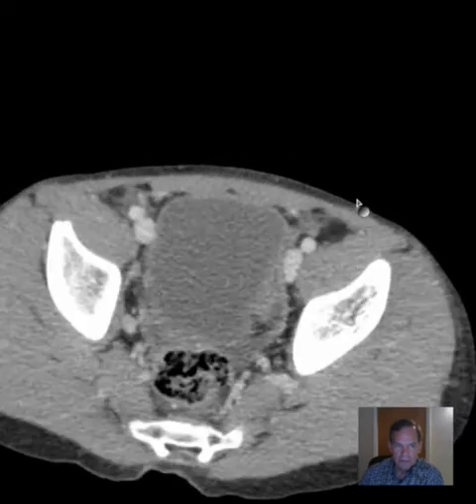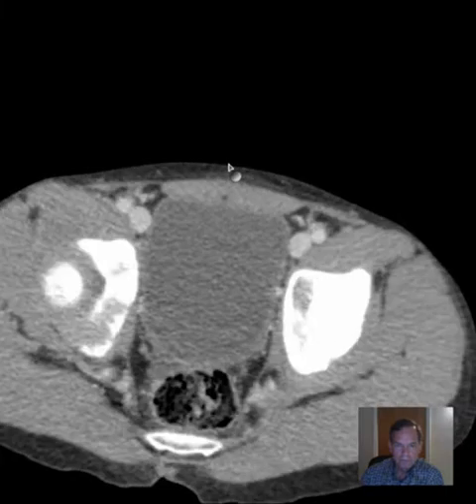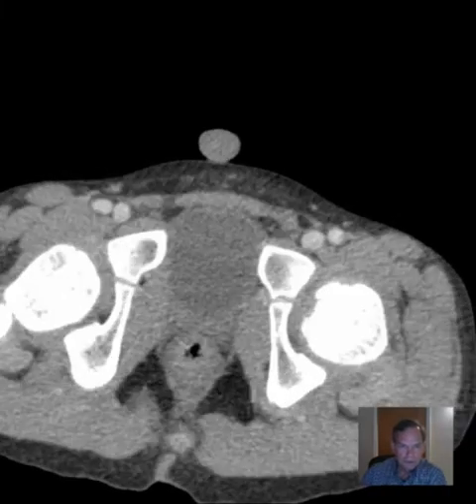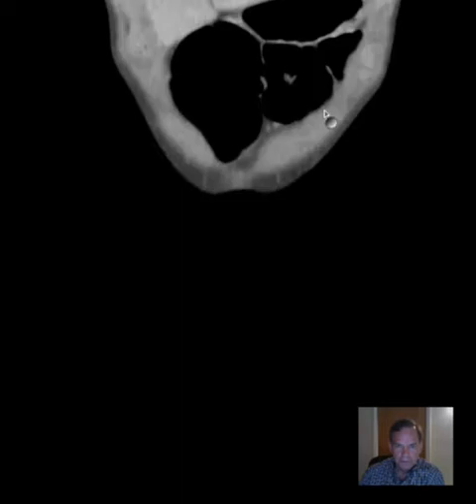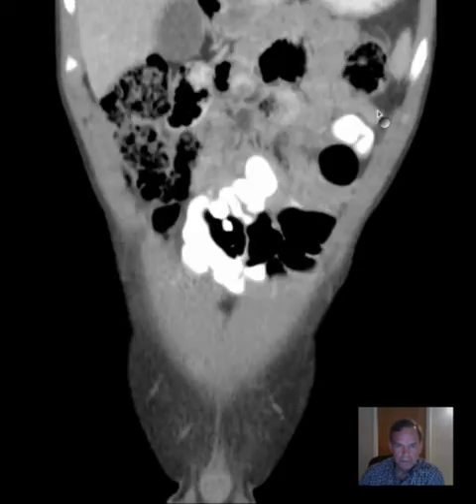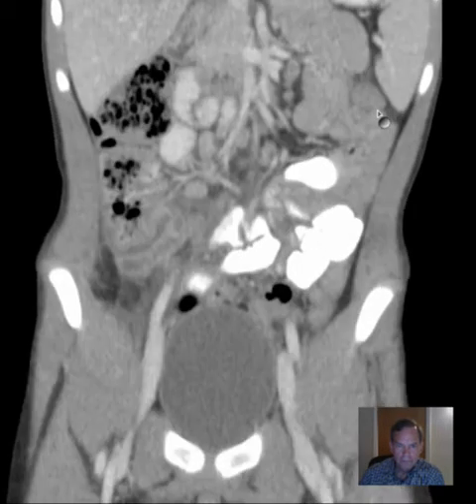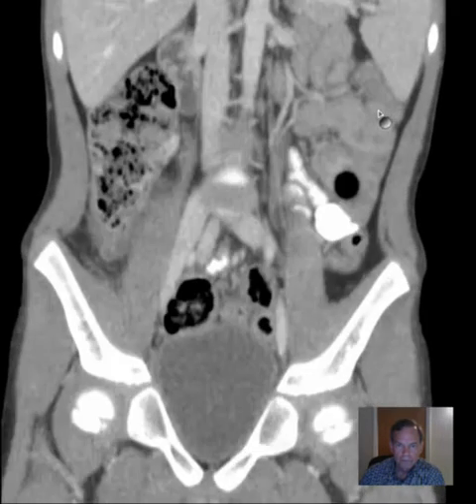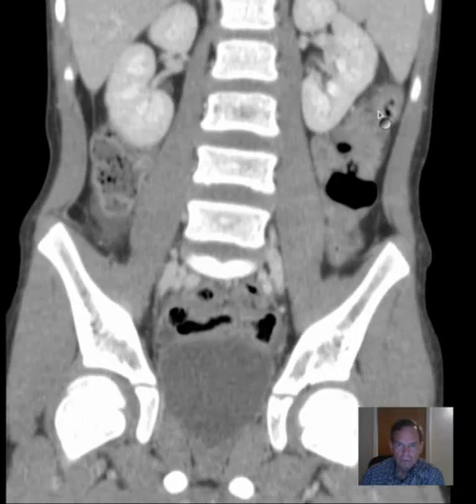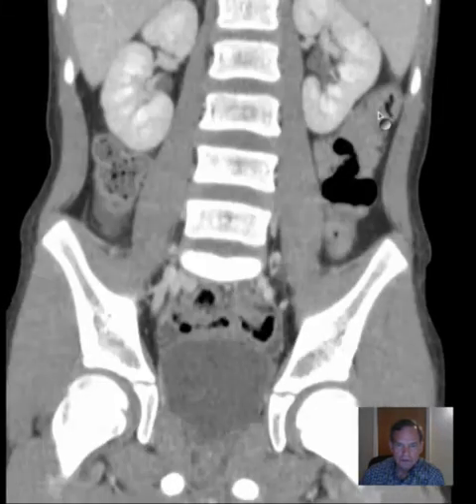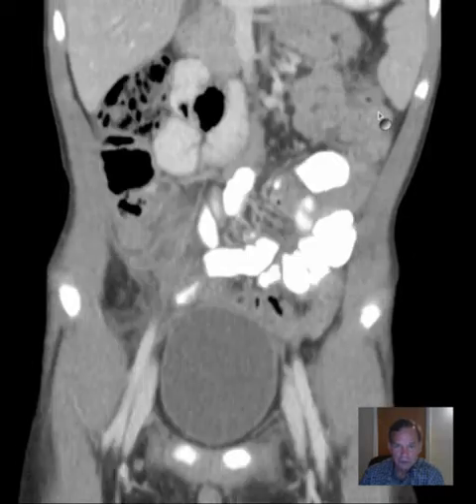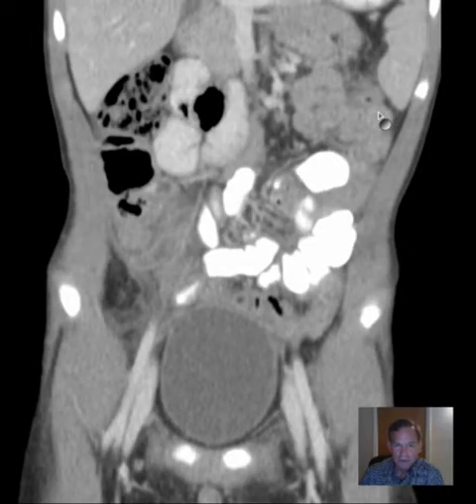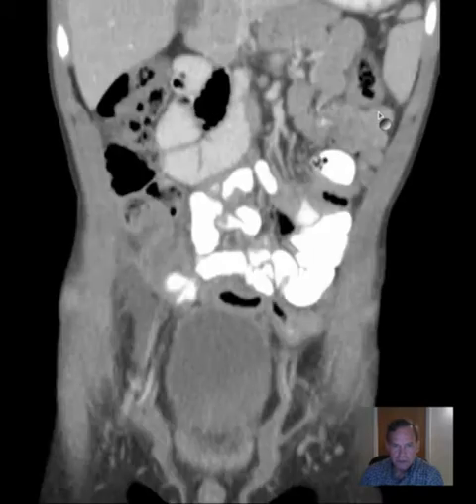So those are the axial images. Let's take a look at the coronals now. You can see we've excluded the upper part of the abdomen, possibly because this was done with particular concern about appendicitis.